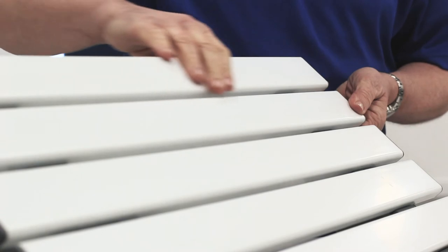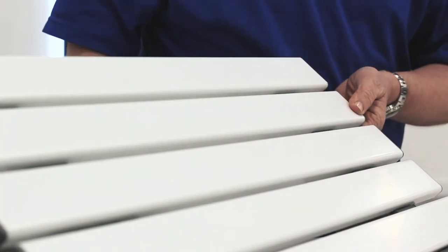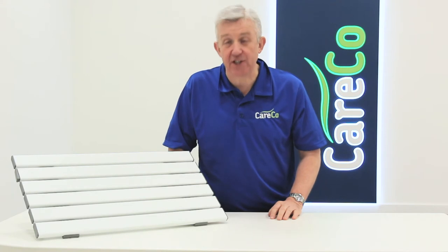The board has been crafted with a slatted surface to help water drainage, and the water resistant materials prevent rusting or mould. The aerial adjustable bath board, part of the wider range of bathroom aids from Careco.